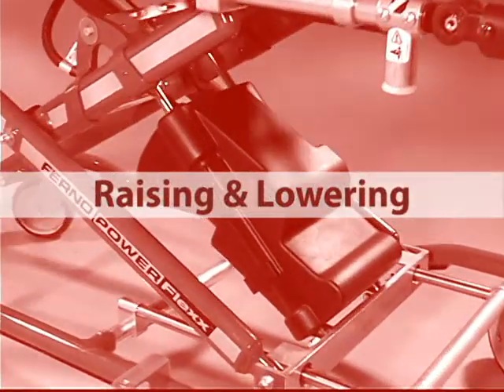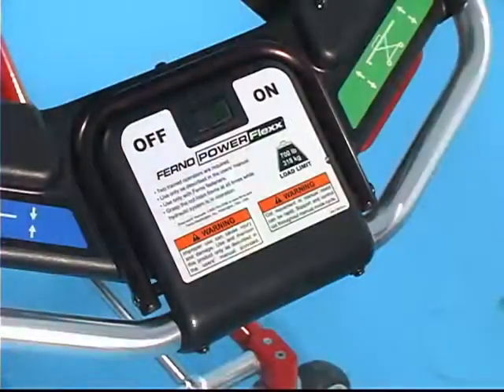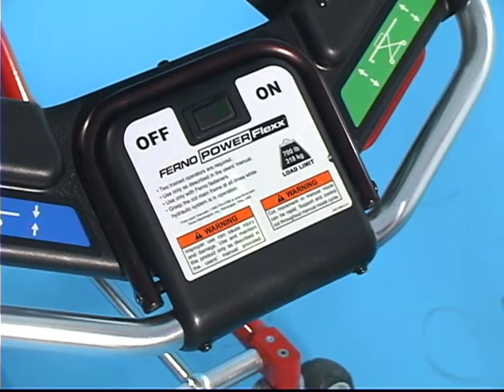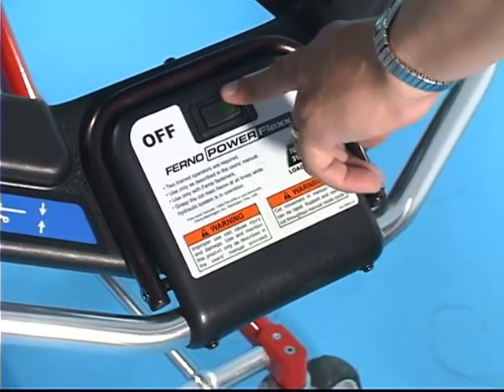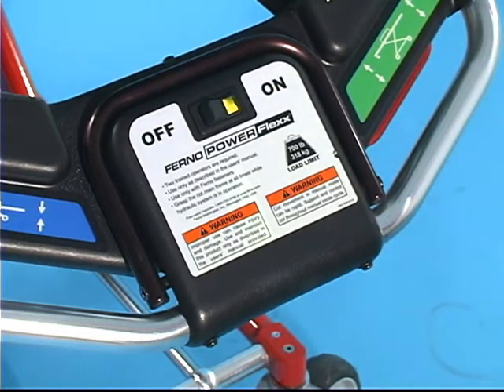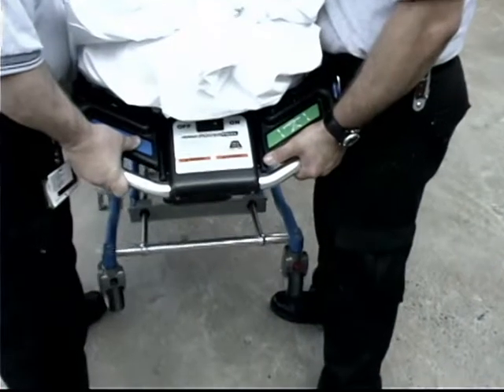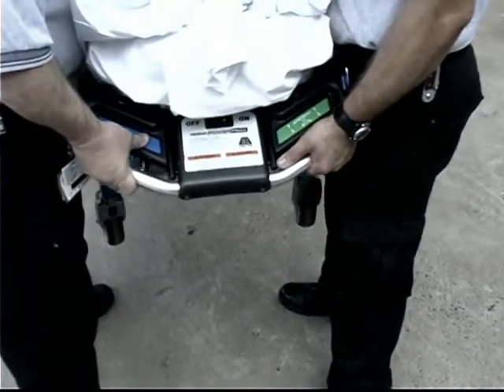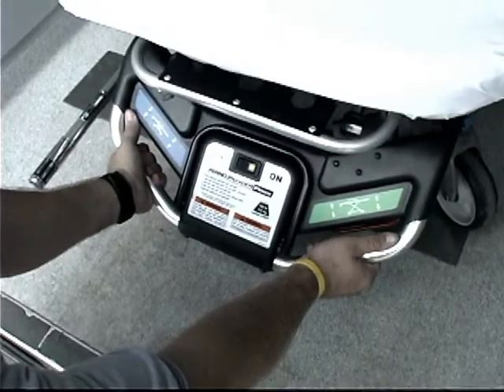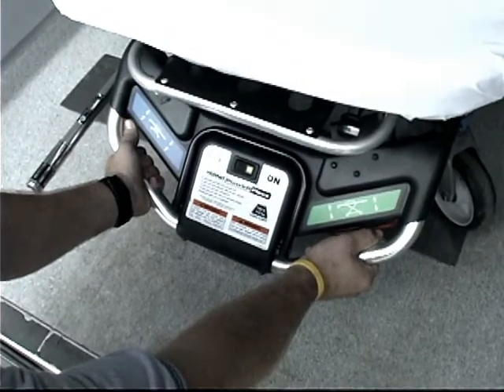Raising and lowering the cot. The main power switch for the PowerFlex is located at the center of the foot-end control panel. Turn the switch on to use the cot in its powered mode. A green light in the switch indicates the power is on. Large touchpads on the control panel operate the hydraulic power system. Grasp the main frame and position your hands so you can access the touchpads with your thumbs.